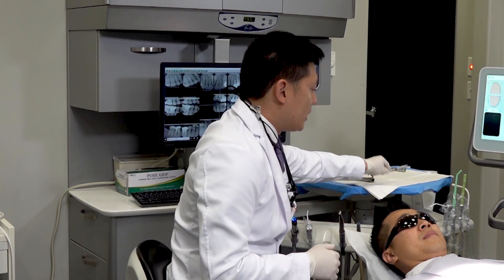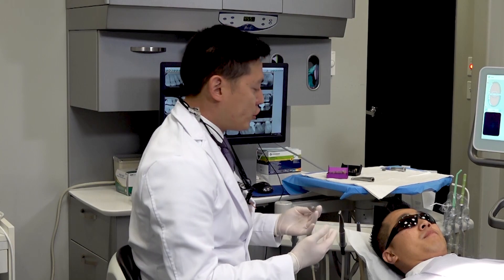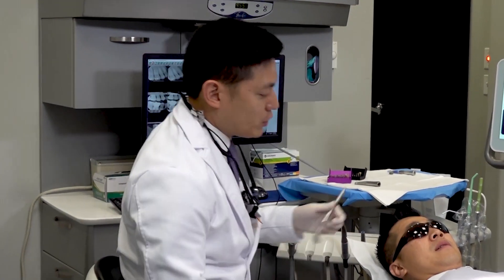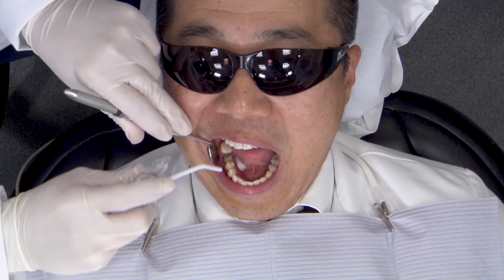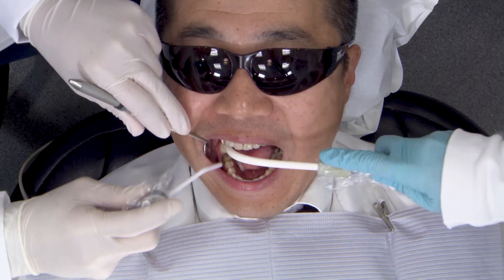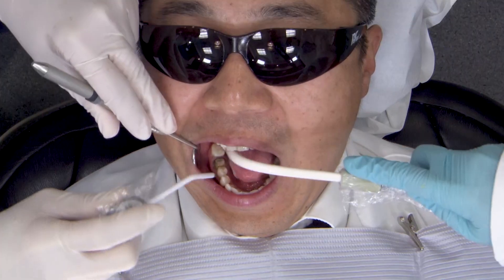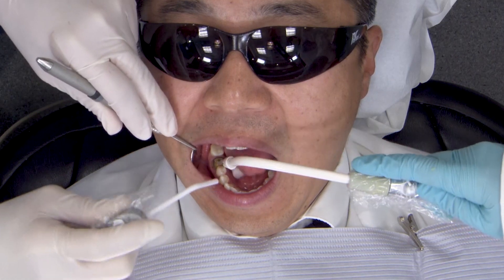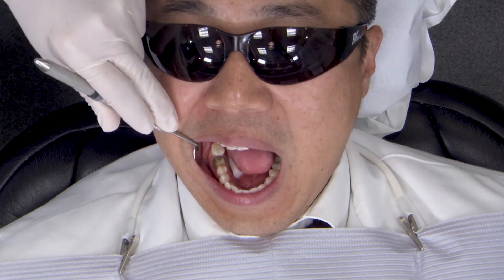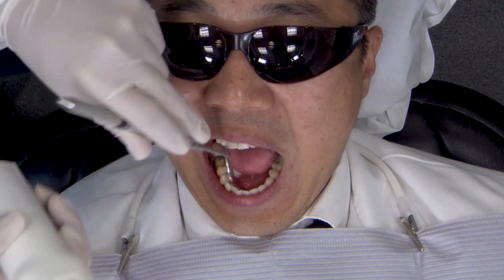So what we're going to do — I'm going to still use my mirror or some retraction aid on the cheek. You also want to ensure that, just like with your initial scan, the teeth are very dry, the preparation is dry, and the area that you're trying to capture is also dry. And you can do this during that initial scan sequence.